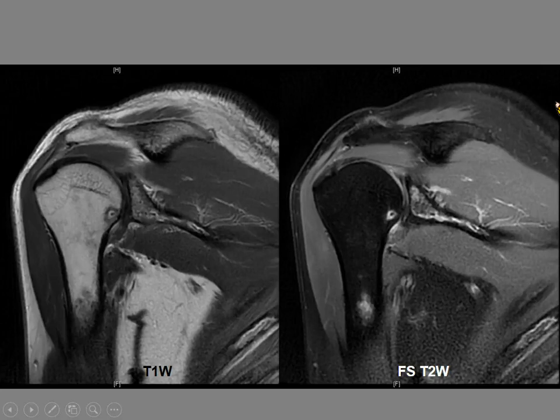What was uncommon was this lesion in the proximal humerus, and we thought that this could be due to early bone infarct, where you get bone edema as a manifestation. But because the patient's pain was persistent, they went on to do a PET scan. And on the PET, this area showed marked increased uptake. There were uptakes in the other sites as well, but they had much lower uptake, and they proceeded to a biopsy, and this turned out to be a focus of lymphomatous infiltrate. And it's not always easy, therefore, to distinguish when patients have multiple pathology.